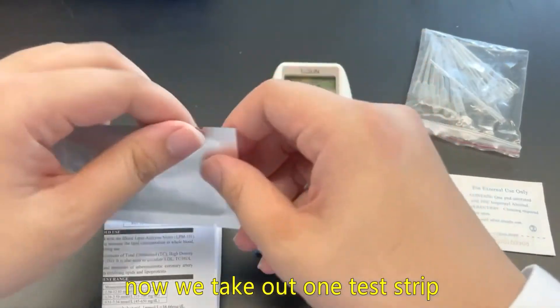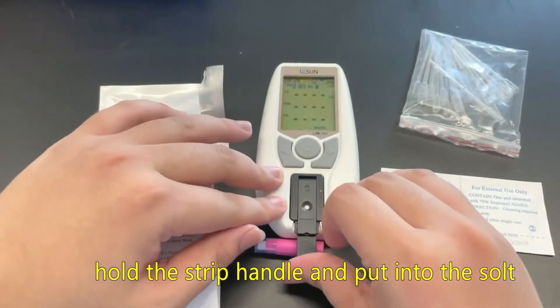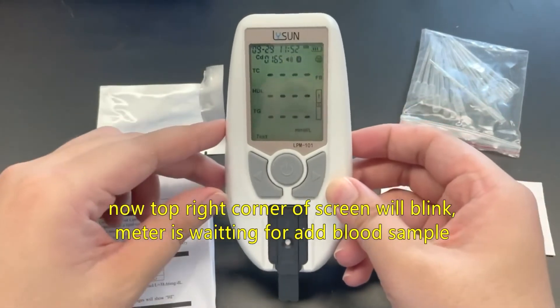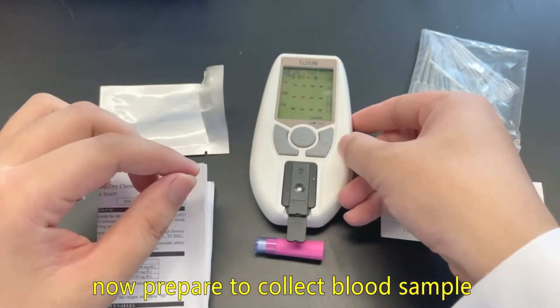Now take out one test strip. Hold the strip handle and put it into the slot. The top right corner of the screen will blink — the meter is waiting for a blood sample to be added. Now prepare to collect blood sample.